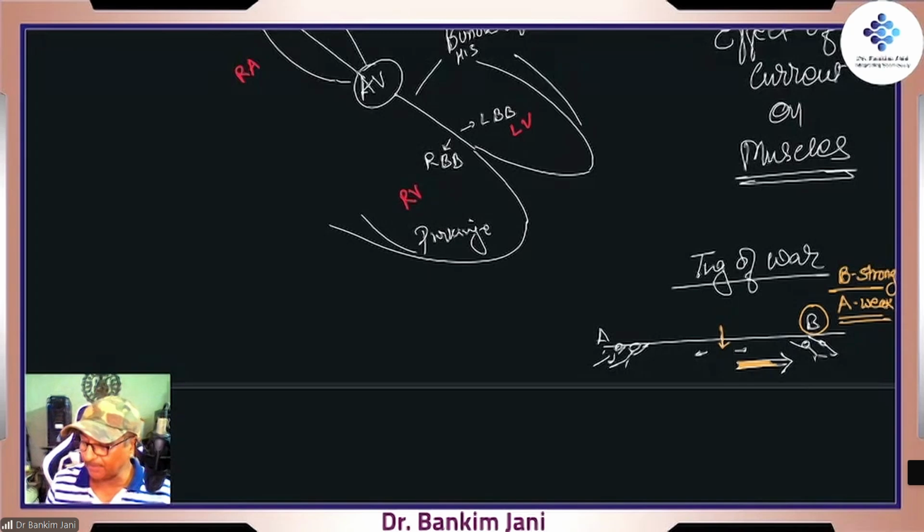So for example, in our case, when there is a shift, either there is hypertrophy or, on the opposite side, there is myocardial infarction. We'll see this, but this is just the concept you have to remember. Exactly the same thing will be implemented one after another on every ECG.